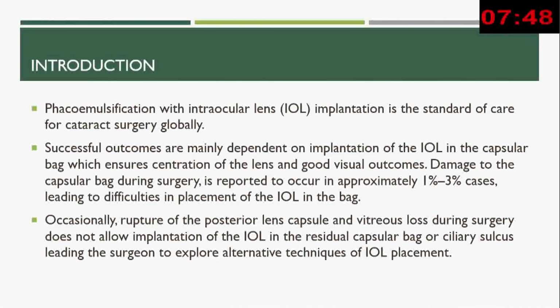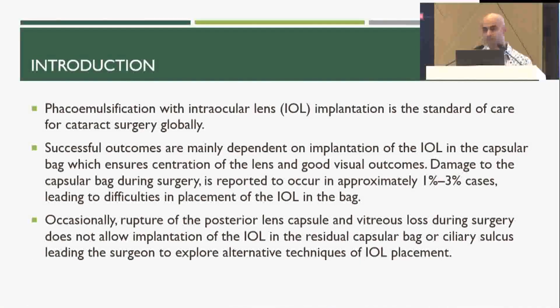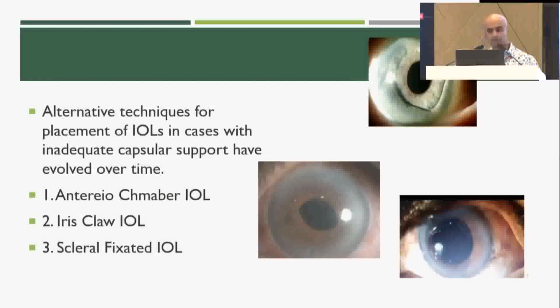So I'll be talking about sutureless scleral fixated IOL, and I'm sure all of us who do phacoemulsification, a situation where we have a posterior capsular tear and inadequate bag support is not new to us. Thankfully, this complication happens in about 1 to 3% in experienced hands, and not all patients require a secondary IOL or a scleral fixated IOL.